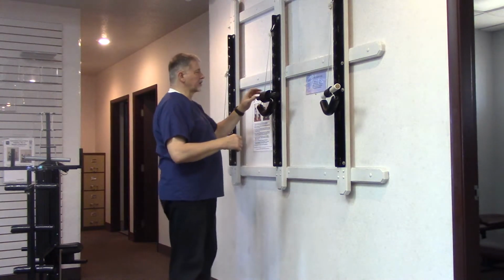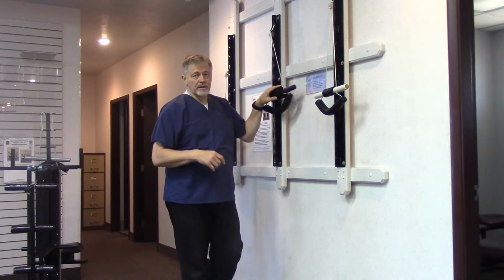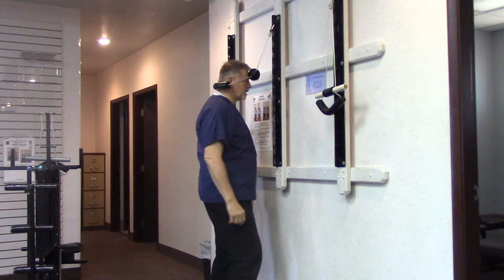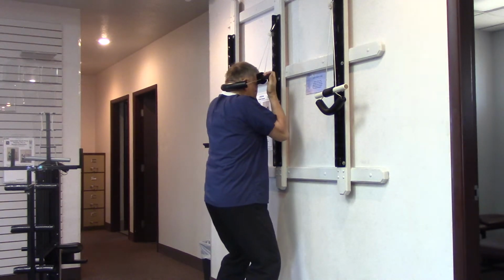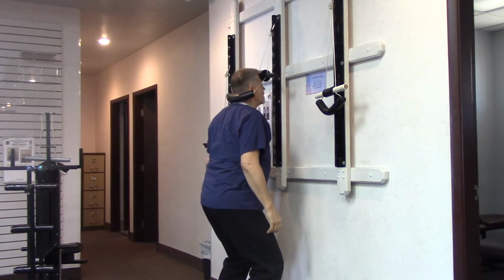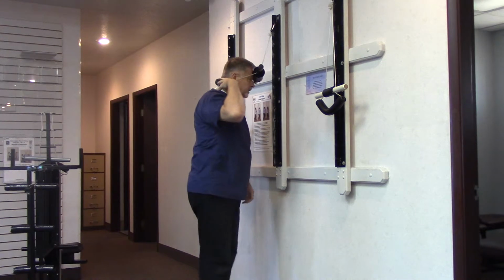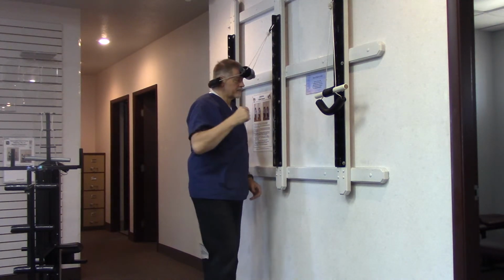Now, if you're going to do it with your forehead, because you're avoiding the TMJ, it's going to look more like this. Now, this is not tall enough for me, but I'm going to get a little bit lower here. But you're still going to hold it. The harder part when you do this is to go ahead and allow your chin to come back. So there's going to be some pressure on the base of your skull and on your forehead when you do it this way, okay?